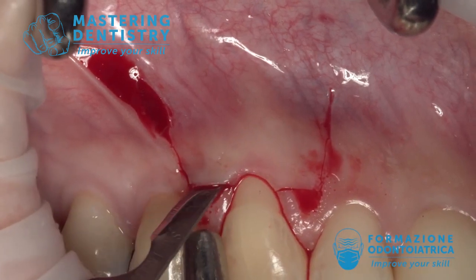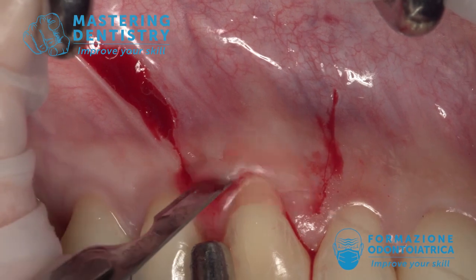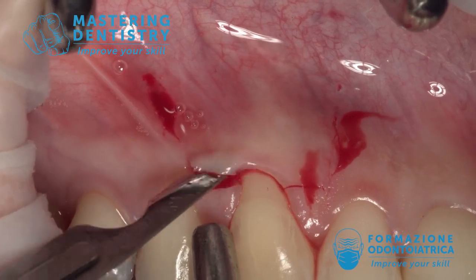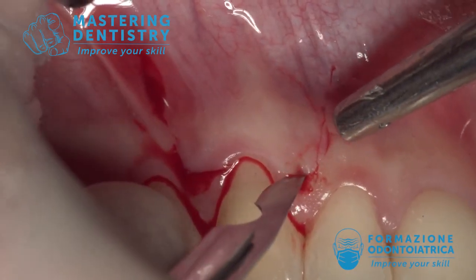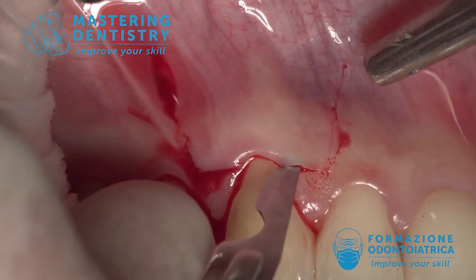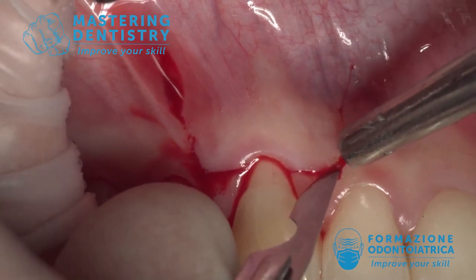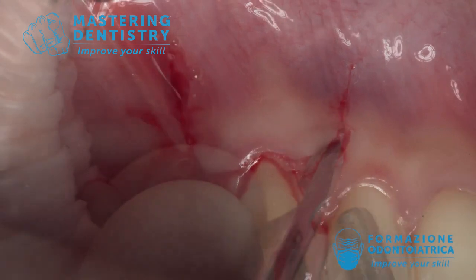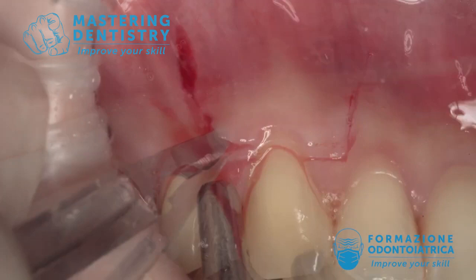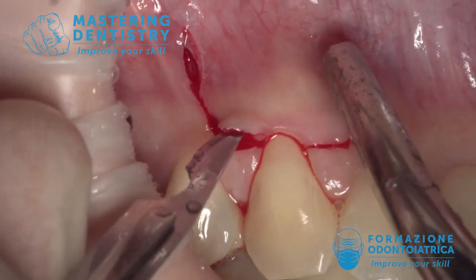In case you can get a little bit more on these vertical incisions, then we have to raise the surgical papilla. Remember what the surgical papilla are — they are the new papilla that will be overlapped over the anatomical papilla. We raise them only with the blade; you see I'm using just the blade and not the tweezers.